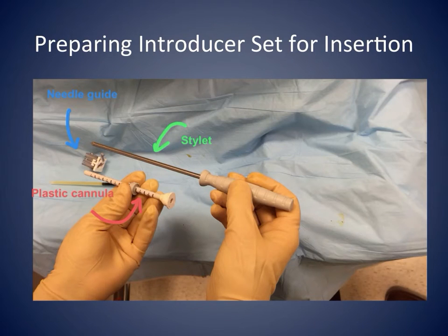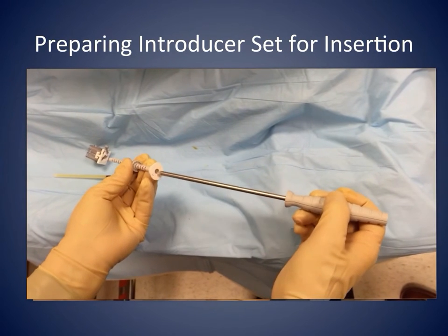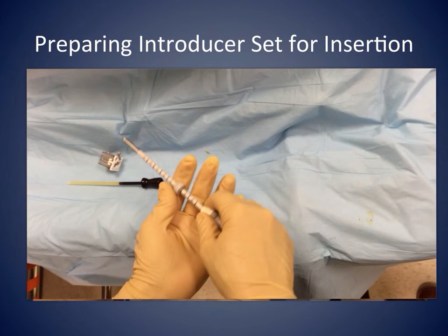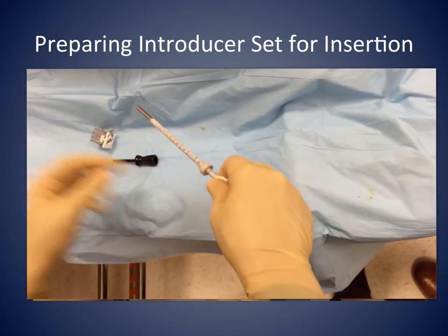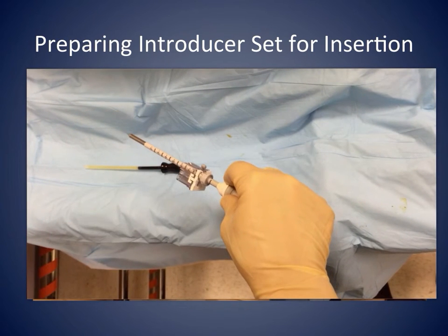This is how we assemble the introducer kit prior to biopsy. First, the stylet is introduced inside the plastic cannula. Next, the introducer depth stop is mobilized by sliding it along the length of the introducer so it can be easily moved to the desired depth later. Then the needle guide is placed over the assembled plastic introducer and stylet. The kit is now ready to be inserted within the breast.